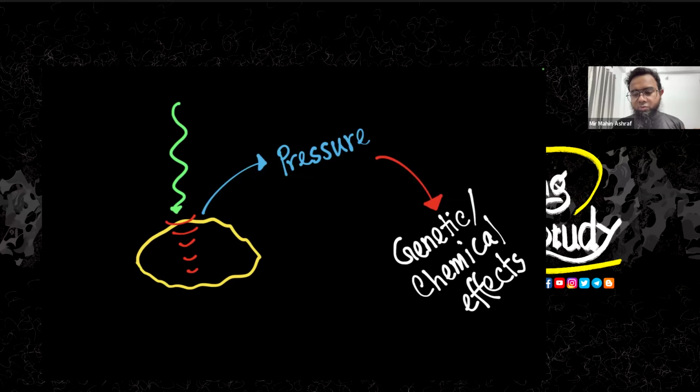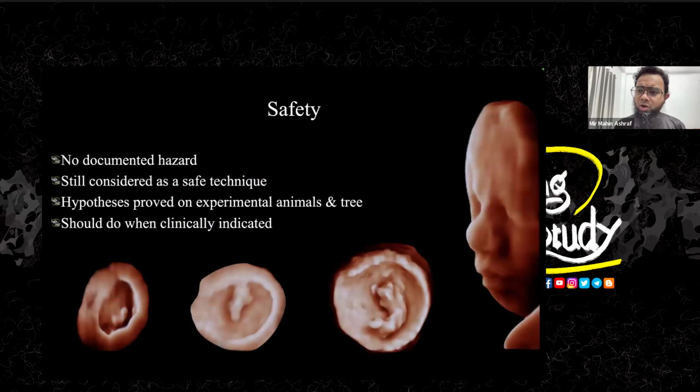So these are the queries which we want to solve in a patient, but fortunately, after long assessment, there is still no proven adverse effect of ultrasound in the human body. We have proved it in lower class animals and trees also. There are congenital abnormalities, postpartum problems, even death. All of this happens in lower class animals, but not in human beings. So whenever there is an indication, you obviously can use ultrasound.